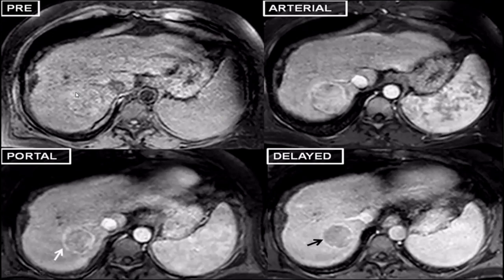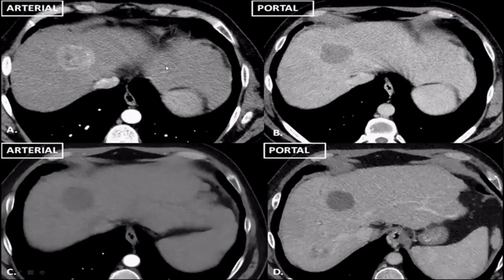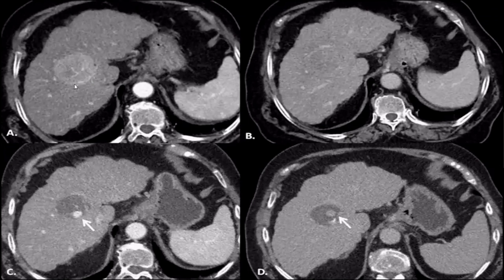This is another classical HCC case. Pre-contrast images show the lesion, which demonstrates characteristic non-peripheral intense enhancement within the core in arterial phase, washout in portal venous and delayed phases, and an enhancing capsule — a classical LR-5 definite HCC lesion. In a treated observation, arterial phase hyperenhancement is present pre-treatment, but post-treatment shows no enhancement — just a lesion cavity with no residual or recurrent lesion. In another treated case, a nodule within the treated cavity suggests residual or recurrent disease.